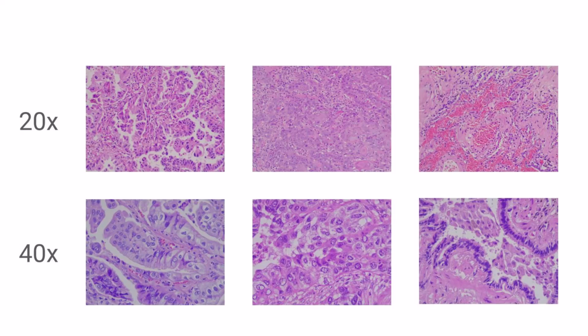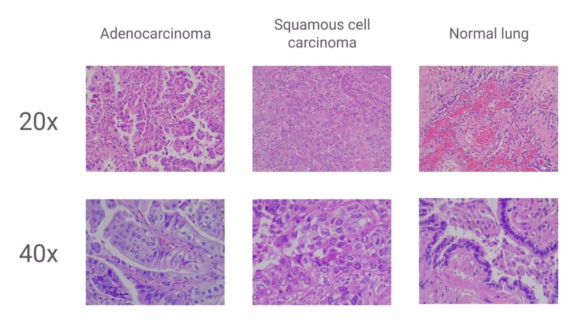As mentioned earlier, the samples are also labeled with subclasses that indicate how differentiable the cancerous tissue is. This applies only to the cancerous samples, since differentiation refers to how many recognizable features the cancer cells have. Looking at the 4 samples on the left, try to guess which ones are well, moderately, or poorly differentiable. Feel free to pause the video and take a closer look.